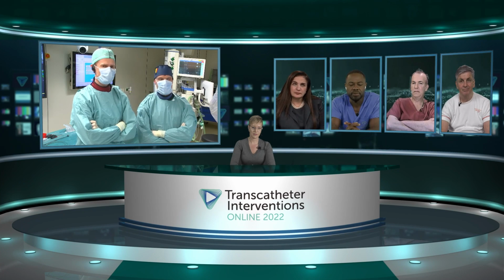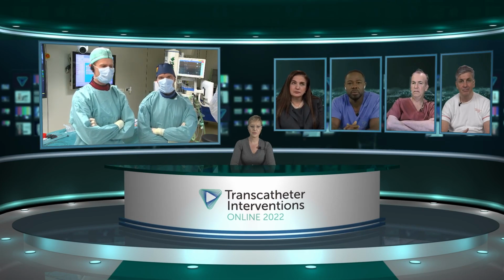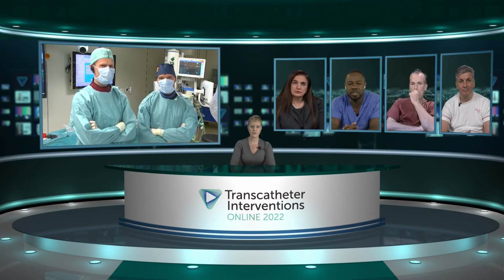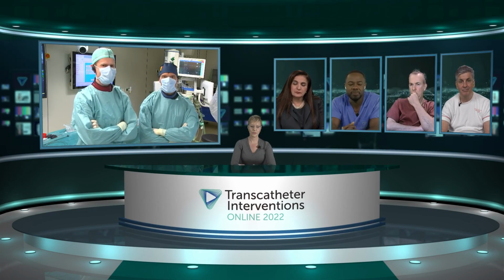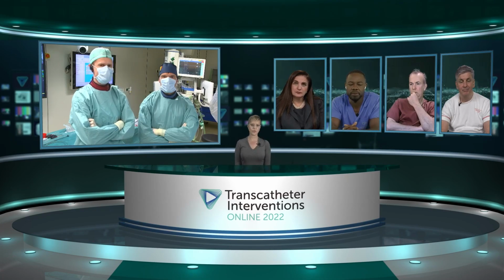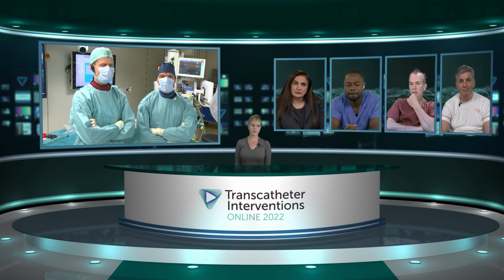But I have to say that the choice of the device is also important. The Navitor with the FlexNav system. The FlexNav system is potentially the most suitable delivery system for this type of peripheral vasculature. But you need to prepare the iliac and the femoral artery beforehand. That would be my advice. Yeah. Any final comments from you, Lars?